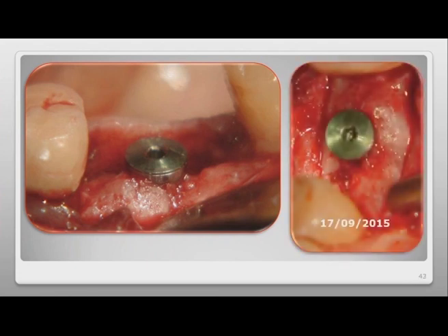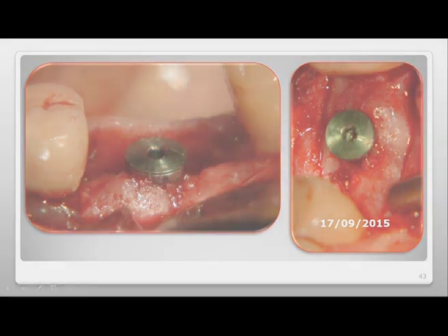Occlusal view. Observe here the amount of tissue that we have in the area where there was only 1 millimeter of active bone and a lesion that had practically taken over the entire vestibular plate of the root.